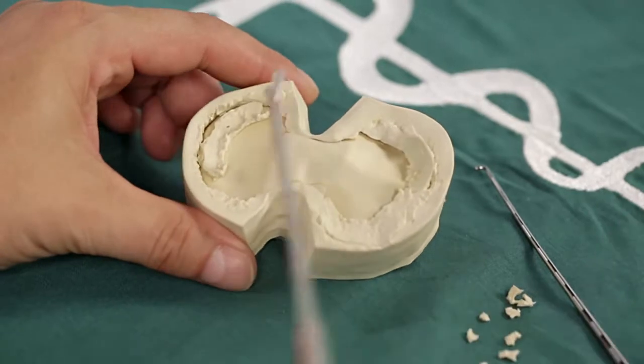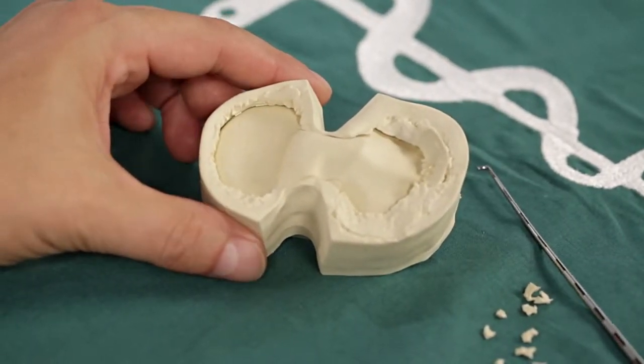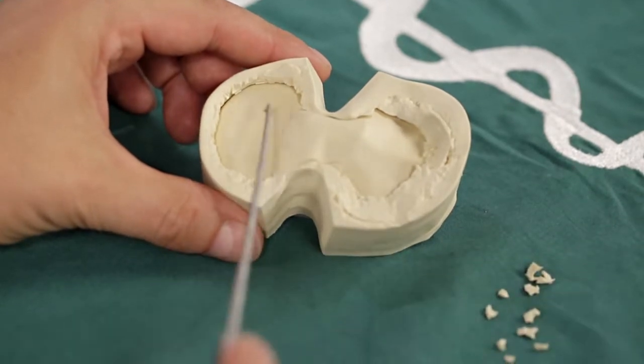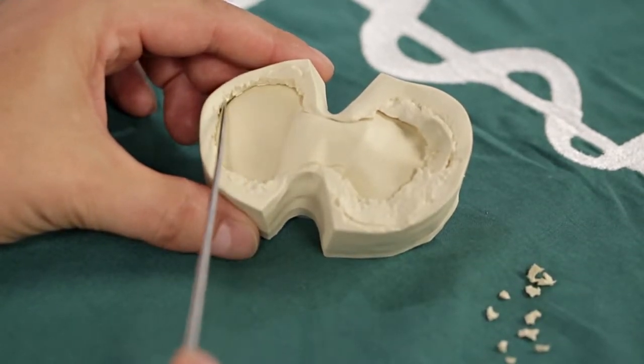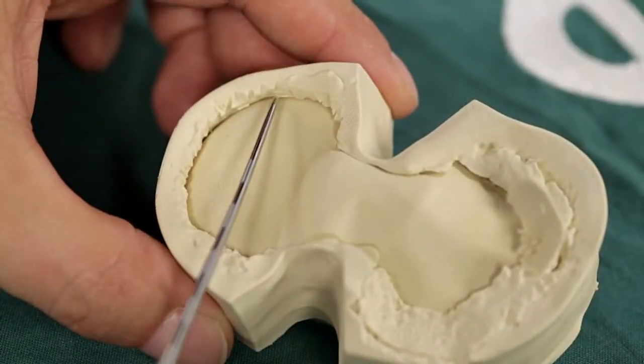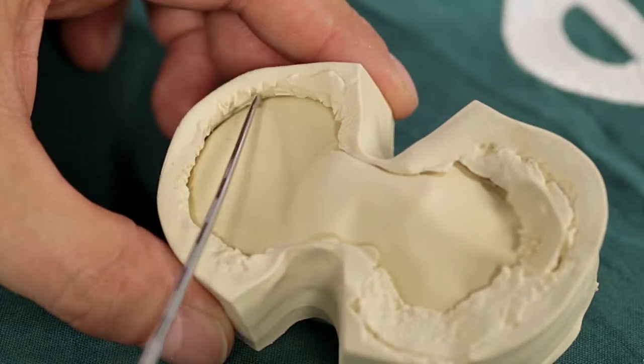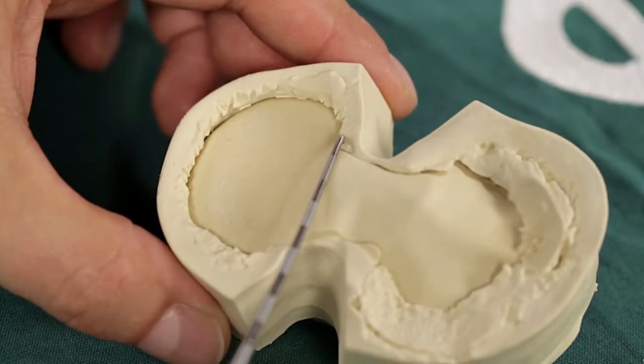Final assessment is performed with the examining hook. Once the simulation has been completed, the material can simply be removed and an assessment carried out — for example by checking the condition and quality of the resection line. This is a key advantage of the physical simulation method, as the results cannot be objectively verified in this way after a real operation.